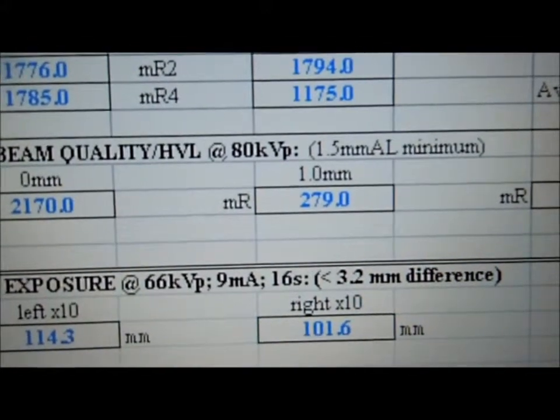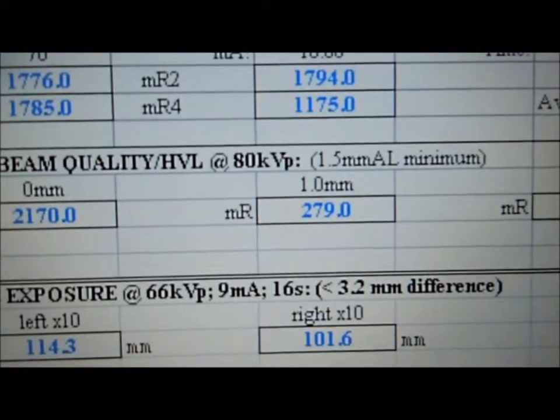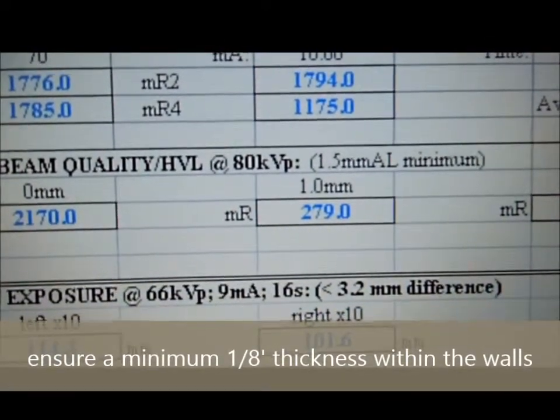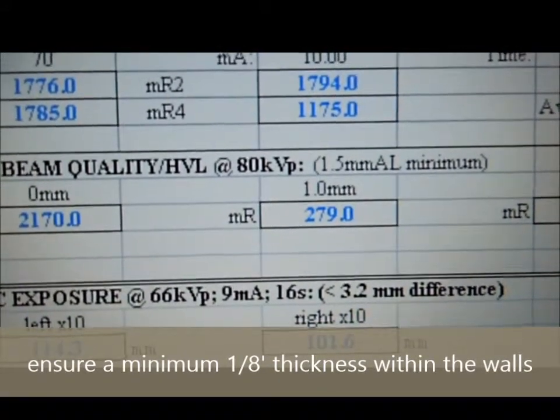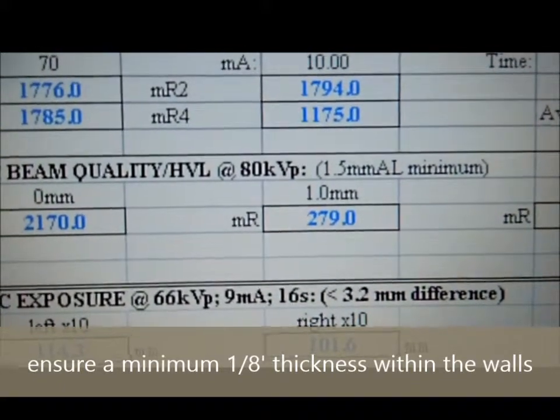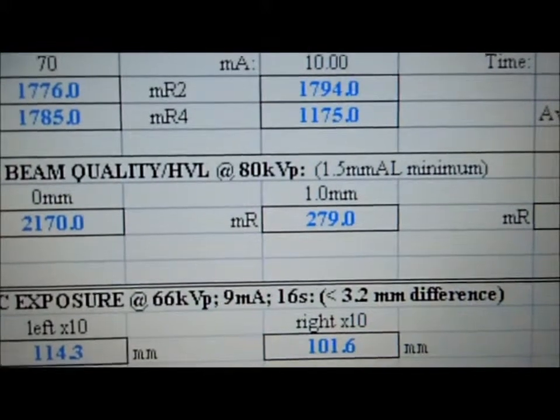to acceptable limits. For example, if the exposure rate at the wall side of the room is 16 arbitrary units and we want the exposure rate just outside the wall to be 2, we would use 3 half-value layers of shielding. The first half-value layer reduces the exposure rate to 8, the second reduces it to 4, and the third reduces it to 2. In practice, there are some other factors that must be taken into account, but this provides the basic idea.